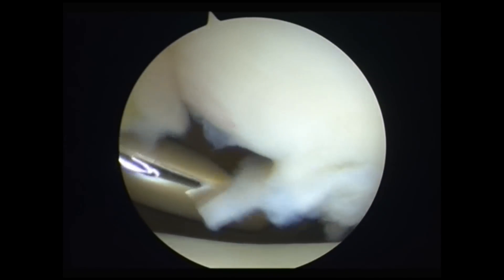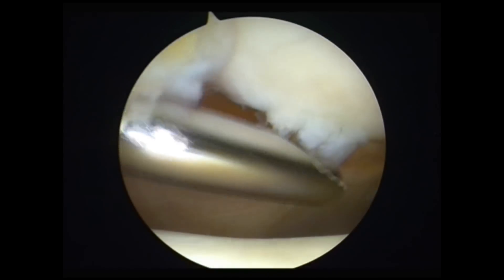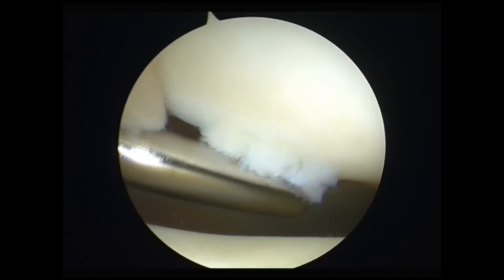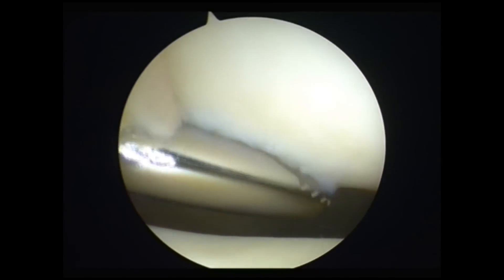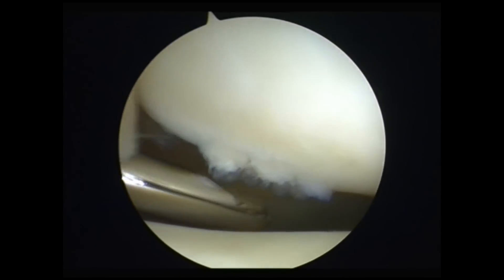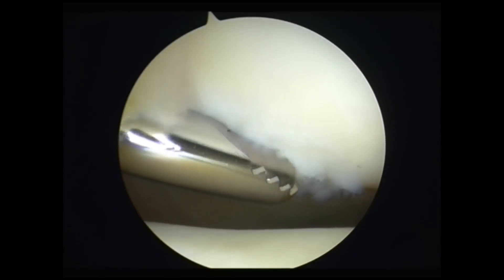That fibrillated tissue has occurred through cyclic loading — a fibrosed part of Hoffa's fat pad that's been impinging in the joint. It's long-term changes that cause that fat to become thick and cause high pressure degenerate change. So that's got rid of most of the excessive tissue.